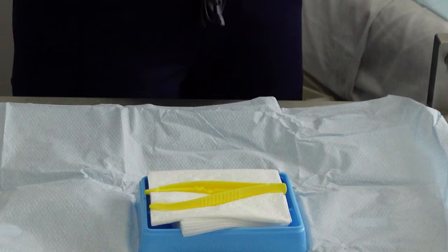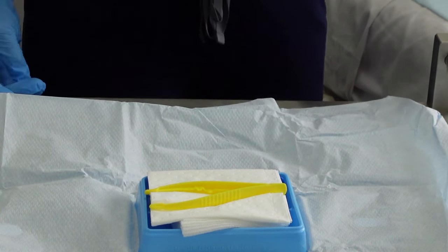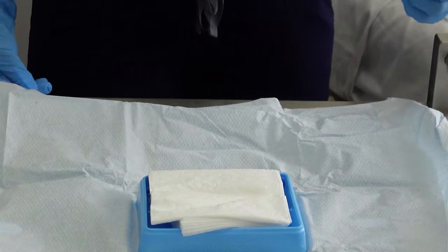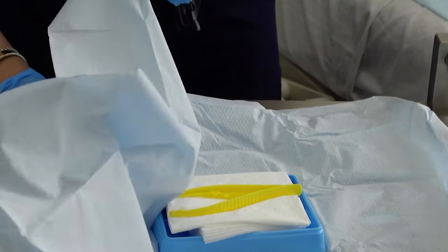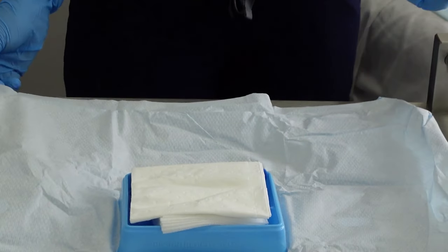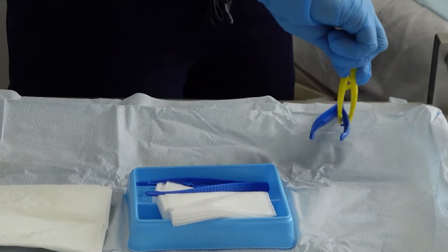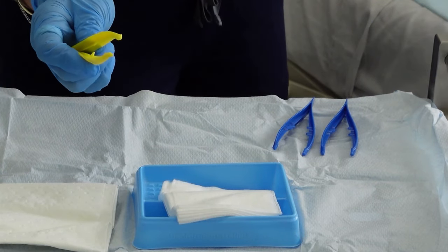In this part, you have to be careful picking up your tongs. There are two ways to do this: one is to carefully grab the end of the tong and hold it this way, and another technique is to grab the tong like this. So it's nice and sterile. The yellow tong I'm going to use to prepare my equipment.